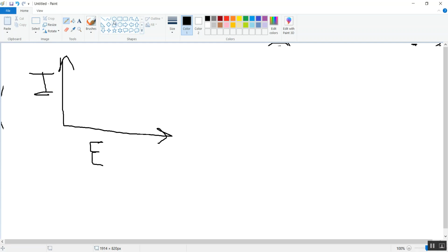Now with different kV, the kV is, for example, 50 kVp, kilovolts peak. I'll extend this curve to be clear for you.